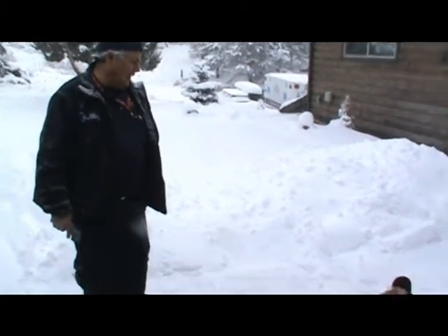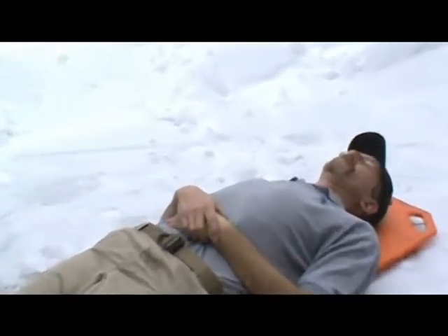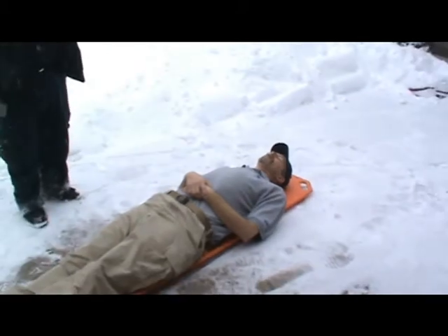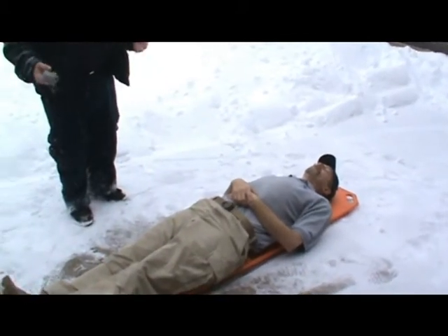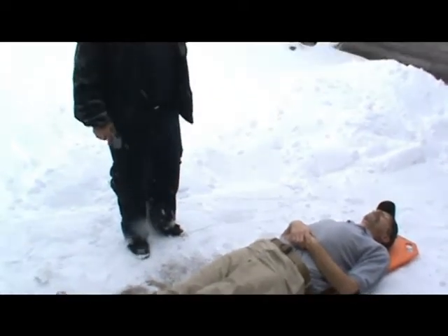Scott, are you feeling cold on that foam? Not at all. It is very warm. What about your arm that's laying on the plastic part? Yes, that's cold. Okay, so we're getting a good insulation, and it's actually reflecting the patient's heat back to him, so we're not going to make him hypothermic.